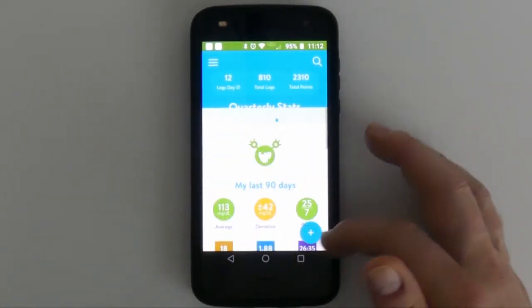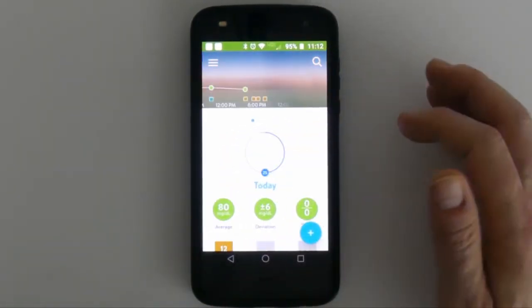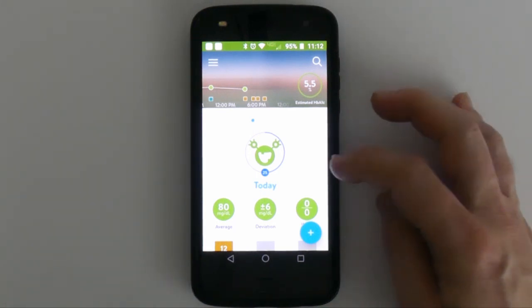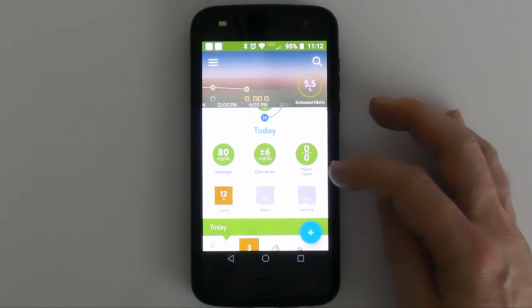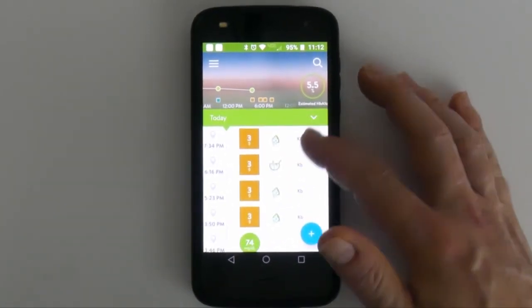So it's a pretty slick little app, very useful. You always have it handy if you're like me and diabetic, and you have to do blood sugar testing throughout the day, or you have bolus or short-acting, short-term insulin. Your tracker's right there on your phone. You know, nowadays everyone has their phone with them all the time. So very, very useful. Again, it's free unless you want the reports that come out of it.